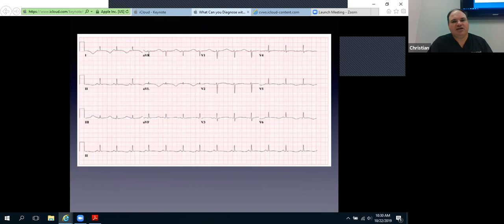So here's another good EKG. This was that patient I referred to earlier that was passing out with loud sounds. You can see there's the Q, there's the end of the T wave. The key thing about this, and the reason I use this as an example, is that checking out the QT interval in every lead is difficult, right? It's hard to find the QT interval there.